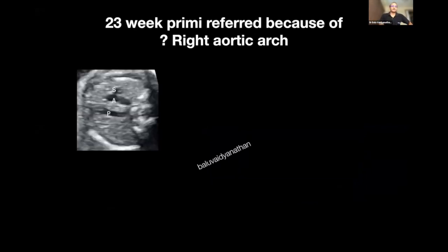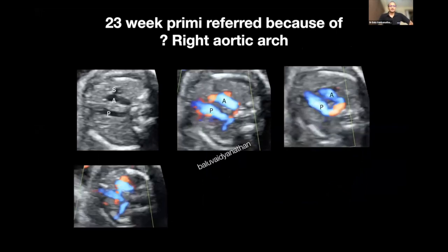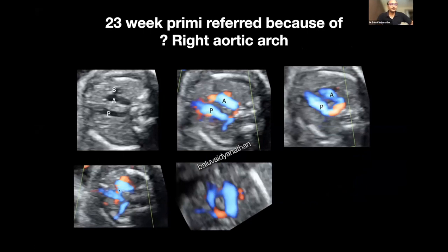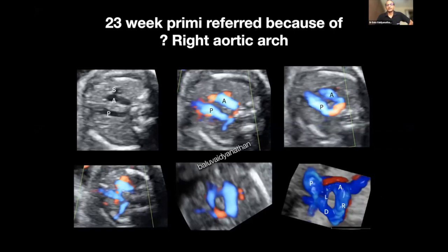In another case, it looks like a right arch at first — you see the U and all that. But then when we looked more carefully, we saw this additional structure, and it turned out to be a double arch. So here we have the trachea, the aorta, a right arch, and also a left arch. A double aortic arch is a complete vascular ring.